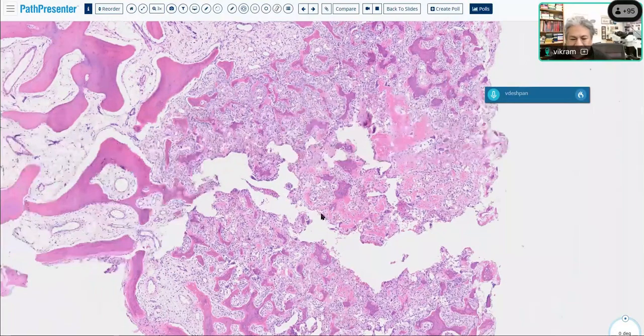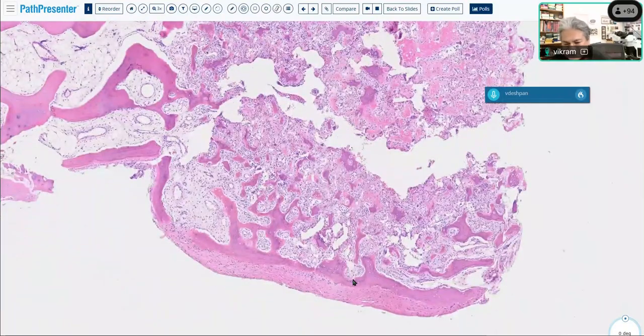What was interesting is that this is an articular osteoid osteoma, and most osteoid osteomas, you're right, are less than 2 centimeters in size. Most osteoid osteomas are intracortical, in the diaphyseal or metaphyseal location. They're generally not intra-articular, so this was an intra-articular osteoid osteoma that mimicked arthritis. This person was felt to have some sort of an arthritis, some sort of a tendinopathy when it was just an osteoma.